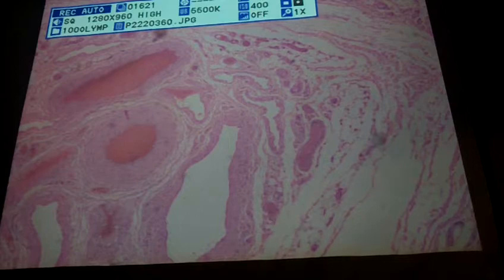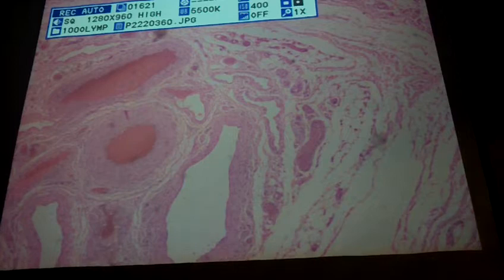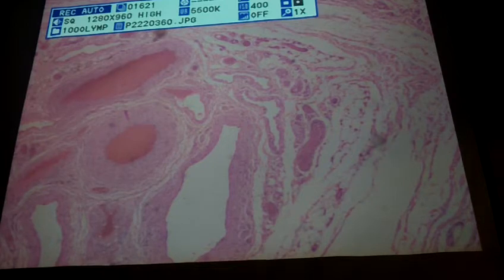Can you see the microvilli? The what? The microvilli. No microvilli on these guys. Am I reading the wrong thing? Yeah, no microvilli on these guys. They're just transporters, right? They're either transporting blood or they're transporting sperm or semen. So no microvilli on these.